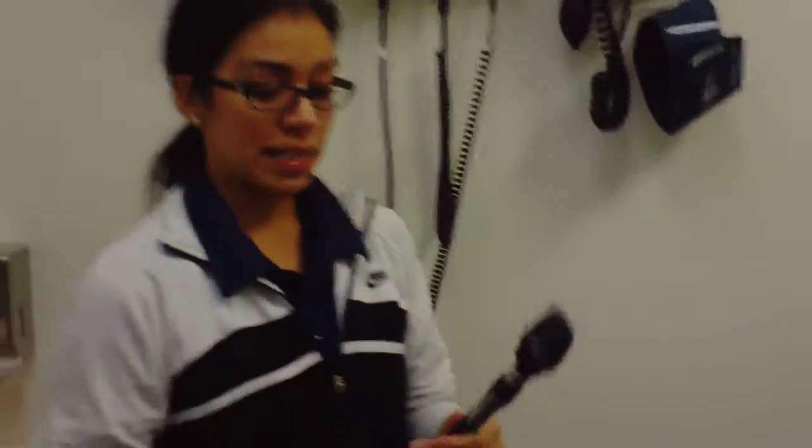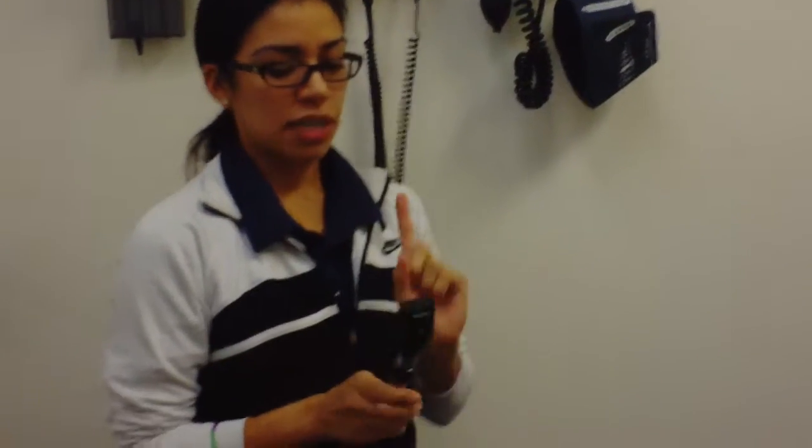Okay, so now we will move on to the very last test. We call the retinal exam test using the ophthalmoscope. Okay, so Jenny, I'm going to have you sit back down. Okay, so the first thing I want to do is appropriately adjust the settings to the ophthalmoscope for myself. Now, what I'm going to do is set my short focal length setting first, then my infinite focal length setting. Short focal length setting would be the green numbers that appear in this ophthalmoscope, and then they would be red for the infinite focal length.